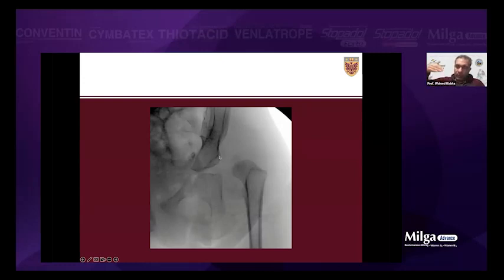Once I cut the iliopsoas tendon, it gives me a huge room to go inferior and medial. Make sure you continue dissecting around the capsule as far inferior and as far medial. If you look at the picture here, focus on this area. The capsule usually is hanging around there. So keep cleaning at the top of the capsule all the way down, and you make separation of the capsule. I use the cob also to separate it from the abductors at the top. And I go a little bit over the top, but not too much posterior, so it won't affect the blood supply. So I go all the way there.